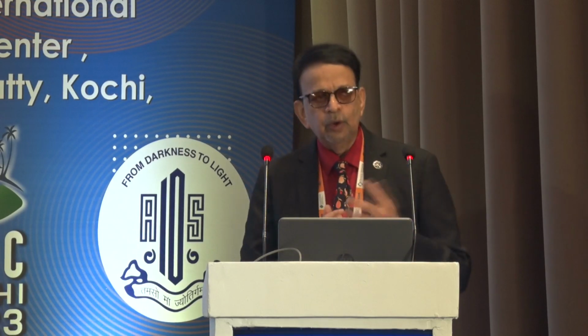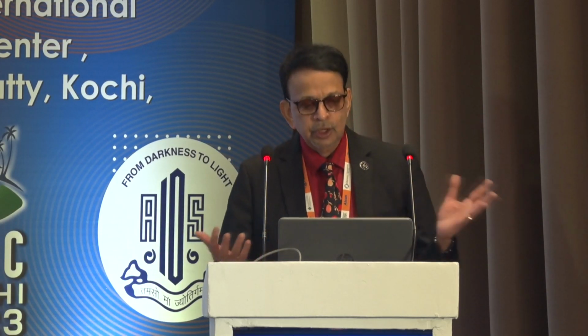So visualization is very important. The reason why I tell all my postgraduates and residents is that you are not good with your microscope, you are not able to focus well, and that is the reason why you are not able to see well, and that's the reason why you are producing all the complications. You should know where your anterior capsule is, you should know where your posterior capsule is, you should know where your zonule or the equator is. And if you want to do that, you need to make sure that the pupil is well dilated as well. So that's again very, very important. You can see how easily it goes off.